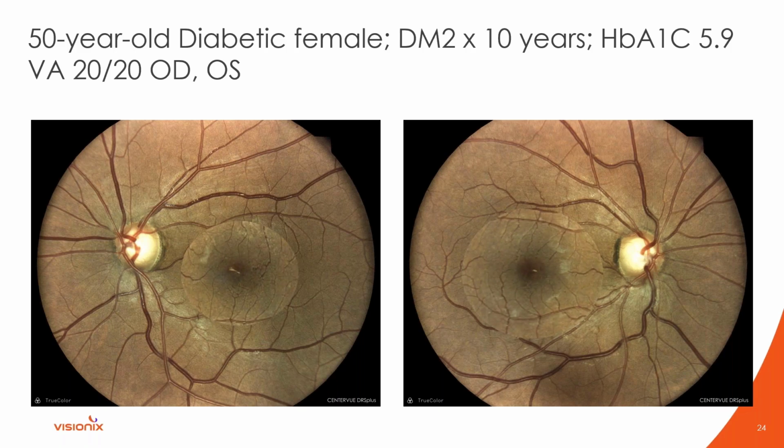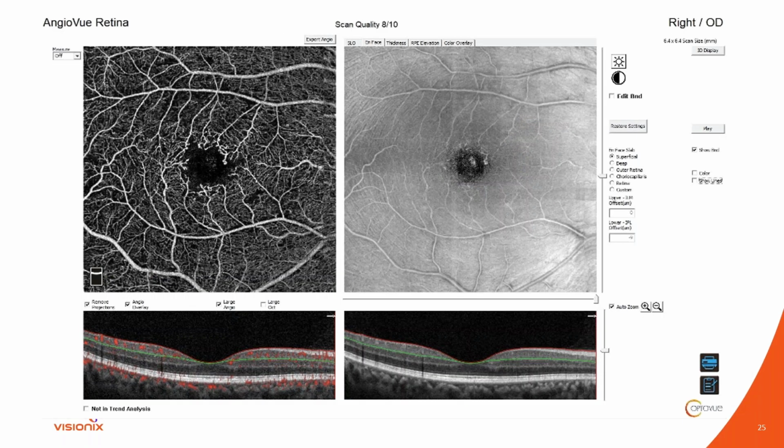And so let me blow these up to show you. It's much more prominent on the left eye than on the right eye, but hopefully you can appreciate this anomalous vasculature here. And it's funny because when I was in the room, I'm like, yes, this patient looks excellent. And then I took the pictures, and the student and I looked at each other, and we were like, how did we miss that? So phenomenal camera, phenomenal images. Regardless, this patient had this anomalous vasculature, but yet they were 20/20. So you know what's coming next: I did angiography.